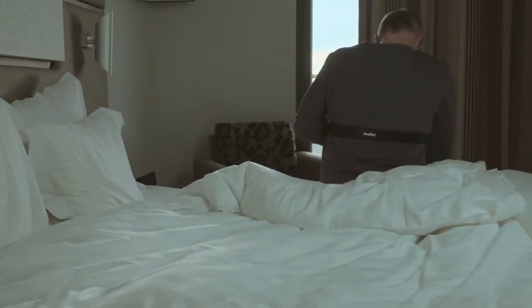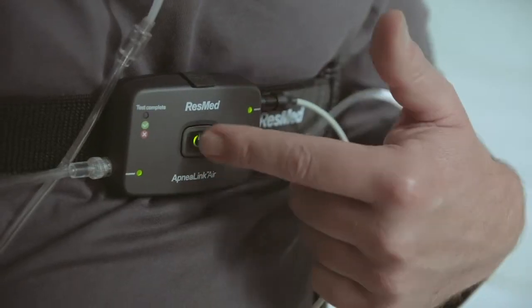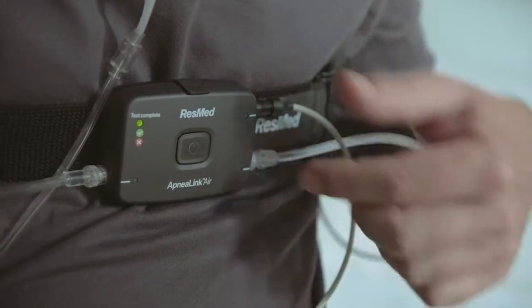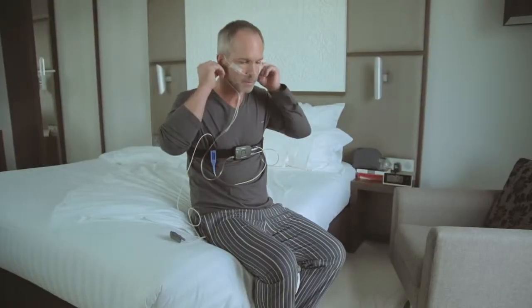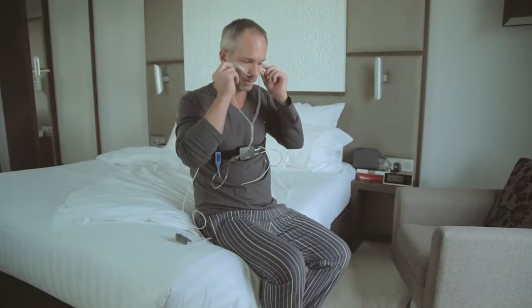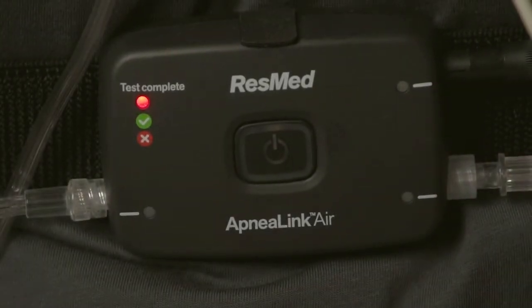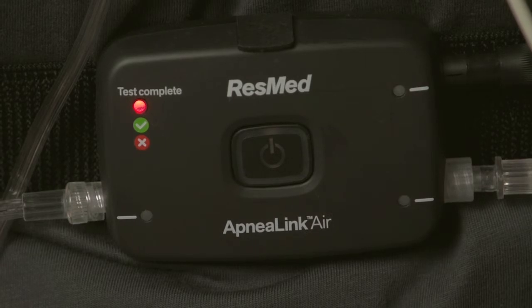When you wake in the morning, turn the recorder off by pressing the button for three seconds. The light will turn off. If the test complete light goes green, you have successfully completed your overnight study and can now return the device to your healthcare provider. If the test complete light is red, contact your healthcare provider as the test may not have been successful.